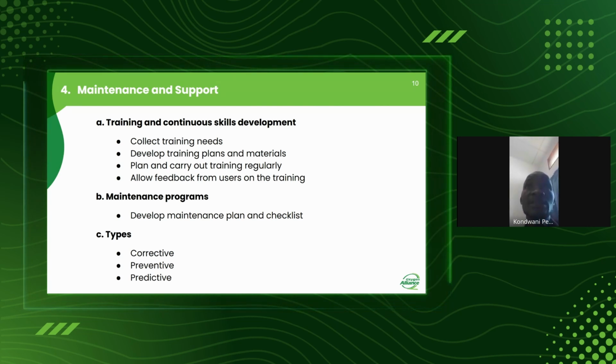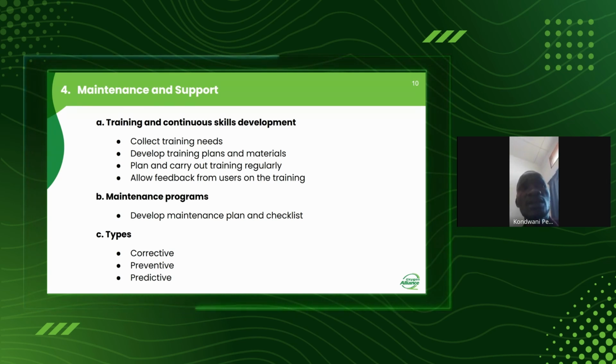This type of maintenance is not common, but it's very important, because here you have an equipment and you can put specific factors like sensors or stuff like that that will alert you that the equipment needs maintenance. For example, it can be based on running hours, or some people will put temperature sensors and say if the temperature reaches this far, then the machine needs maintenance.